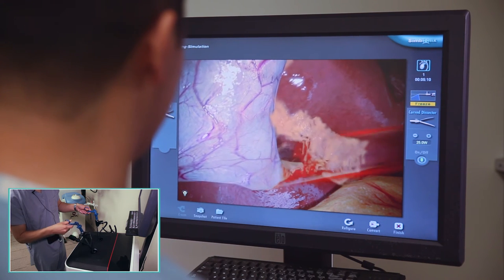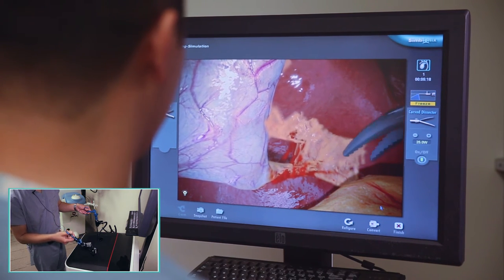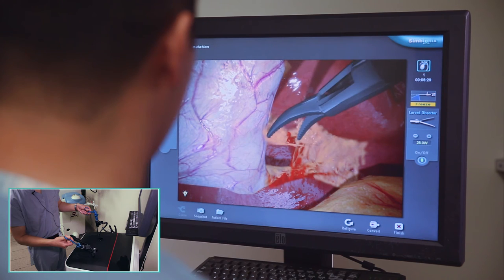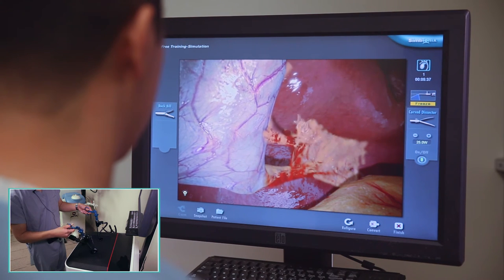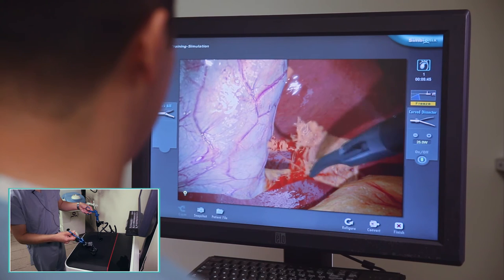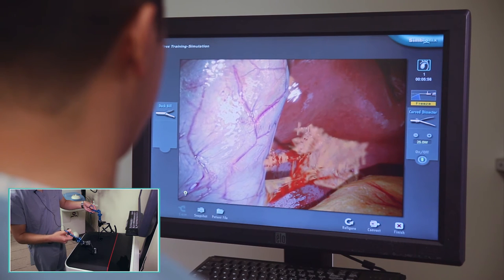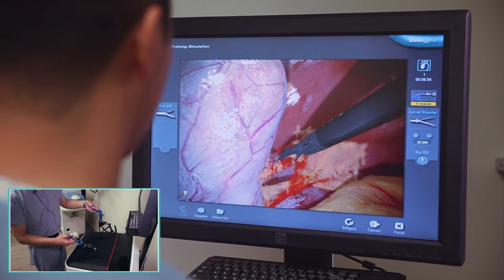The critical view of safety that you need to achieve is to see two tubular structures traveling in a straight line going right to the gallbladder, and you want to see a free edge of liver between those. That would be your critical view of safety, suggesting that you are now ready to put your clips in place. I've defined my cystic duct pretty well, and I can see my artery is hidden up here, so I'm just going to gently take down those adhesions around the artery up at the top. Similar to the cystic duct, you want to make sure there are as few intervening adhesions as possible, so that when you place your clips, they have very little tissue to get through in order to apply pressure on the artery.